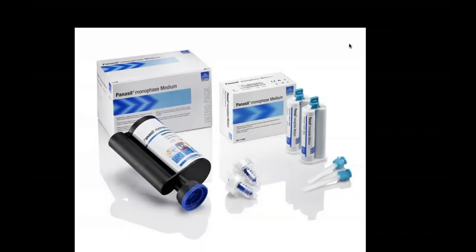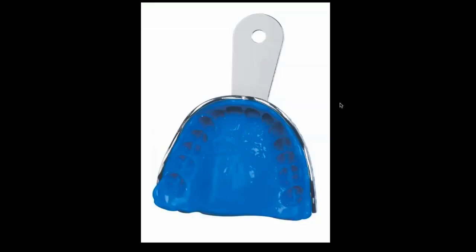This is how the Panasil monophase comes. Again, all their impression materials, or most of them, will come in bulk and also in a cartridge.